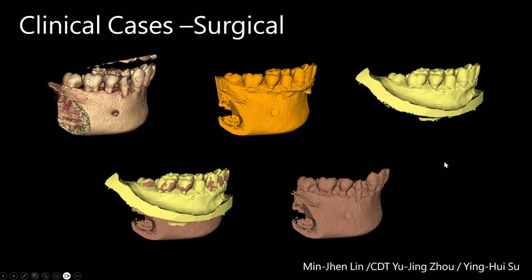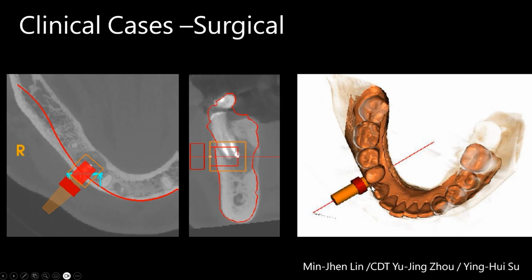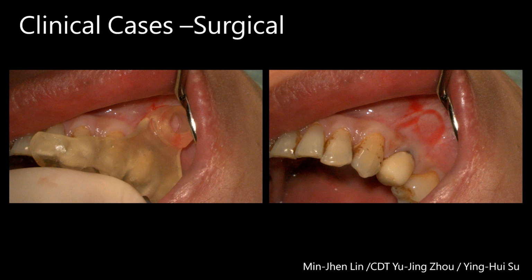As you can see here, the yellow and red line is with the tooth surface and the bone surface, which means my 3D print guide will attach to the bone surface. And here is the 3D print guide. If I haven't reflected the flap yet, the plate cannot reach the bottom. As you can see, if I put this plate here, it will put some pressure on the soft tissue. This will be a reference for how we design the incision. And here is the 3D print guide.